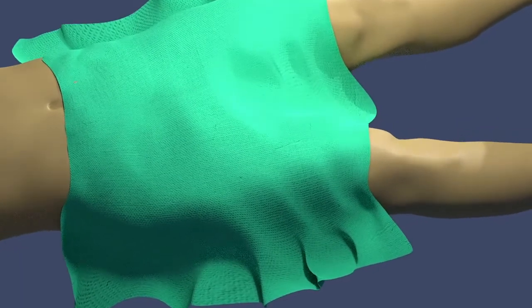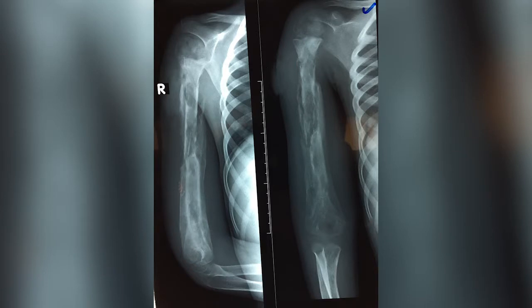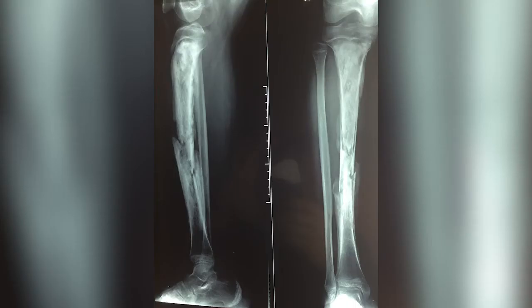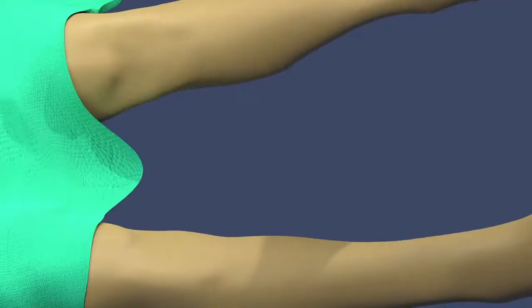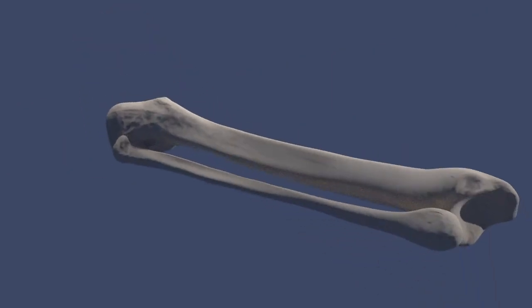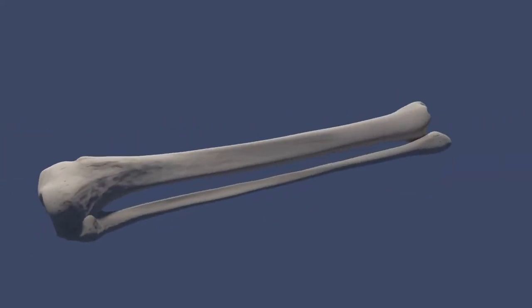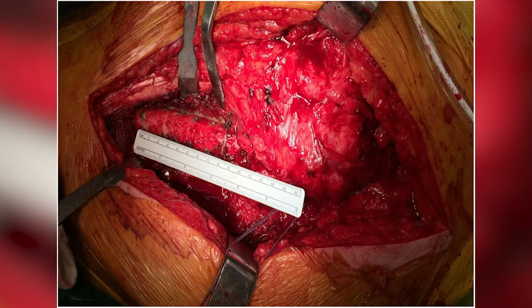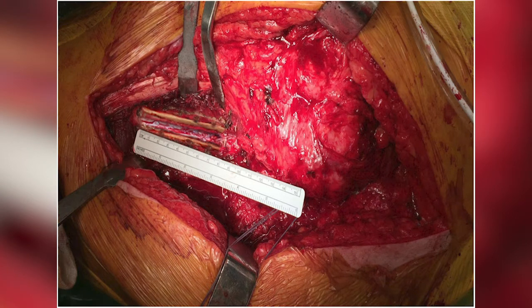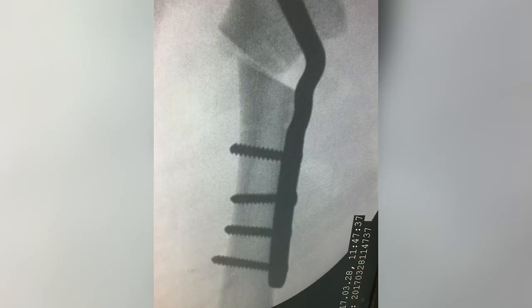In this simulation, we shall use the human tibia, which is the larger of the two leg bones and is the most common bone involved in bone infections amongst children and open fractures in all ages. Learning how to drill this bone is an essential and potentially life-saving surgical skill. The skill of drilling the bone is a prerequisite for a number of other critical orthopedic interventions, which include making a bony window, which is called a corticotomy, which is done to open up the bone and drain pus in case of infections and debride the necrotic materials therein. External fixation placement and internal fixation placement as well for fractures and other conditions.